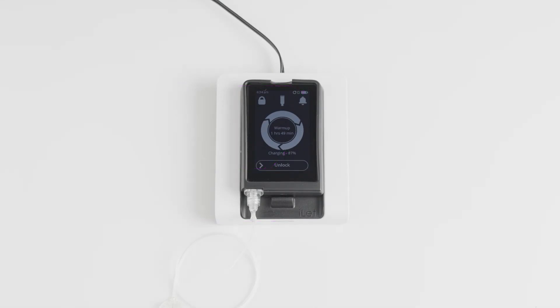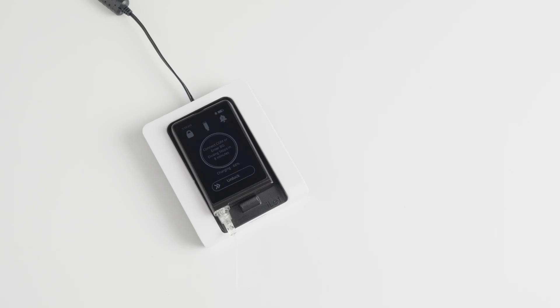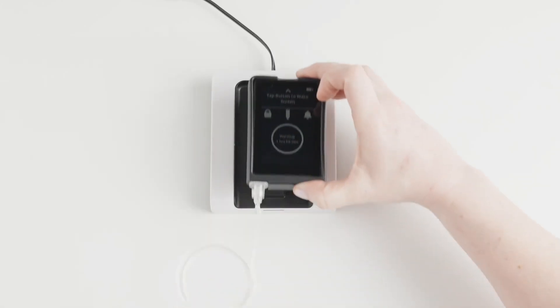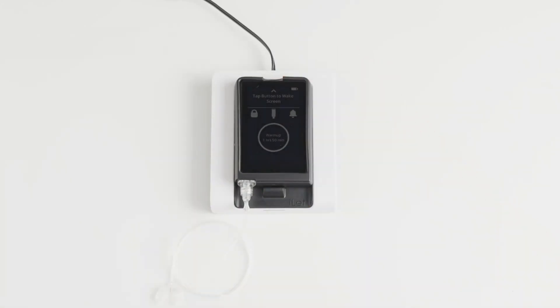If the charger detects the eyelet but it is not charging properly, the status light on the charger will blink. If this happens, remove the eyelet from the charging pad, wait a few seconds, and try putting it back on the charging pad, making sure to put the eyelet in the right position.